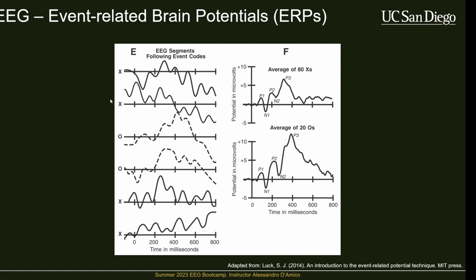So what that means is that over time, as you're recording signals, the characteristics of those signals are going to be changing. So if I record activity from you at time 0, and then I record that same experiment from you 2 hours later, 3 hours later, although the signals will look similar, they're not going to look exactly the same. They're going to be changing over time, and they'll adapt with age, and they also change between individuals.